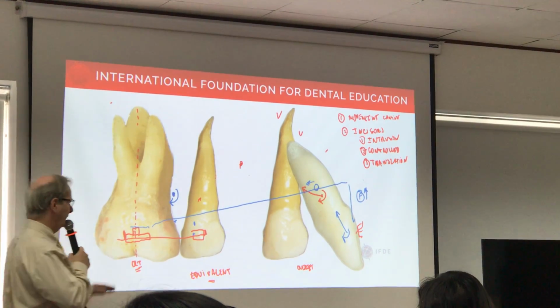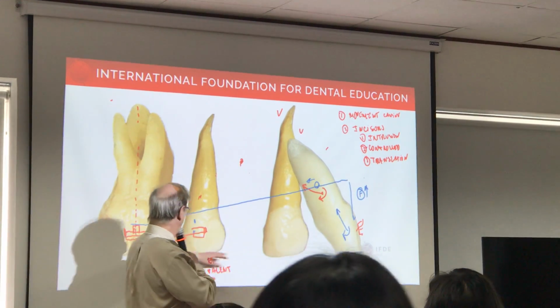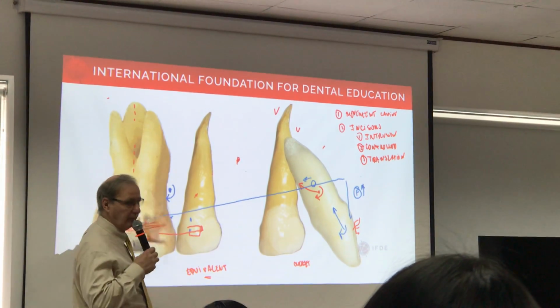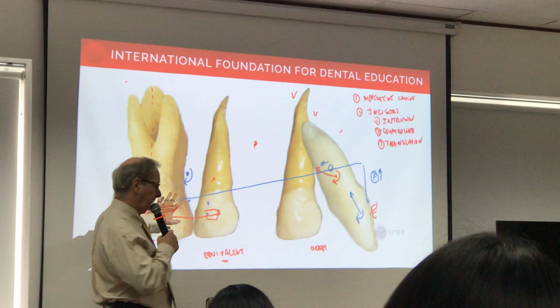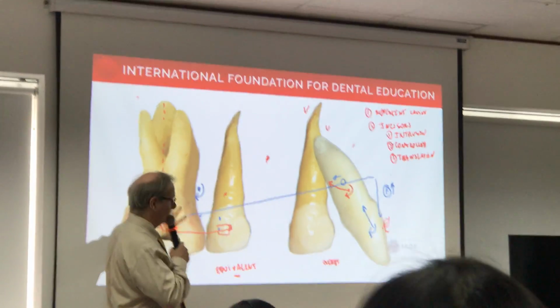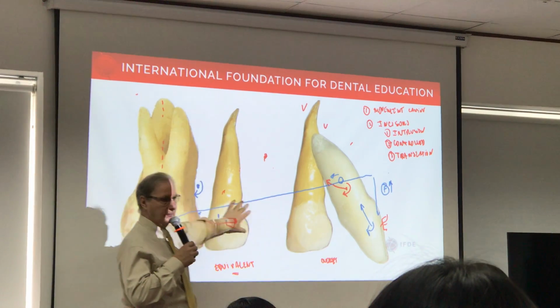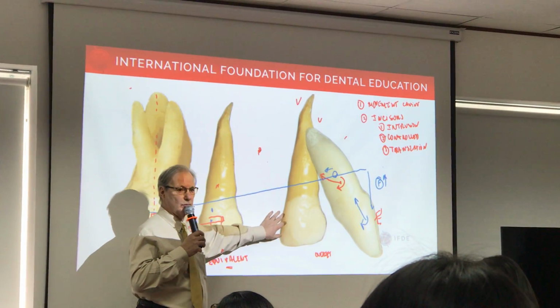So the concept is, if you can do a power arm here and put a DB bar and a lot of stuff that we'll talk about in 5 minutes, and increase the anchor unit on this side, you can probably distalize everything nicely without too many problems.